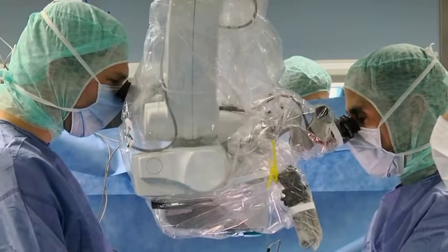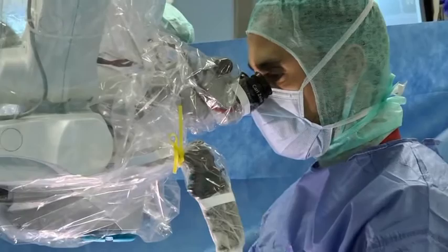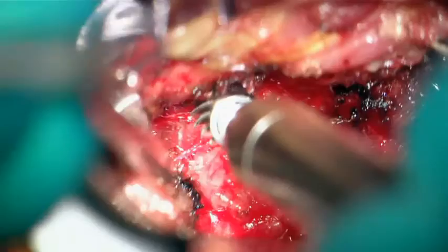A tubular soft tissue distractor is inserted, and both the operating table and surgical microscope are tilted 15 to 20 degrees to the contralateral side. The neuroforamen and the medial and caudal aspect of the cranial pedicle are exposed. Decompression is then performed through resection of the lateral aspect of the facet joint.